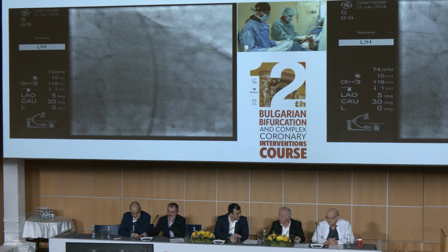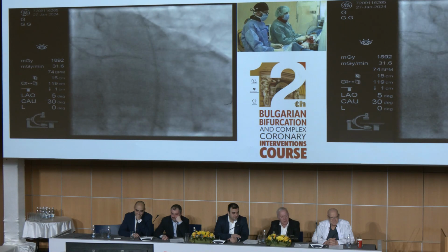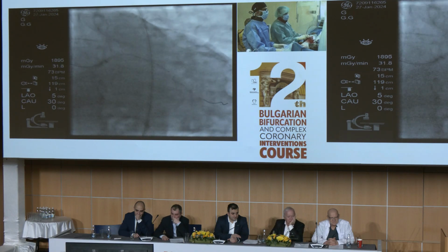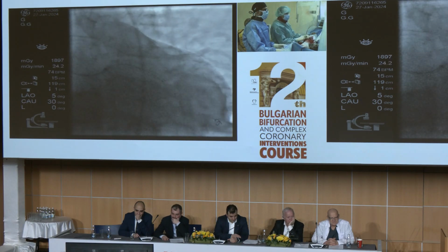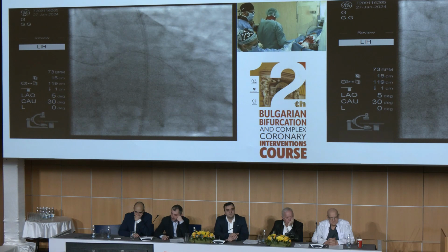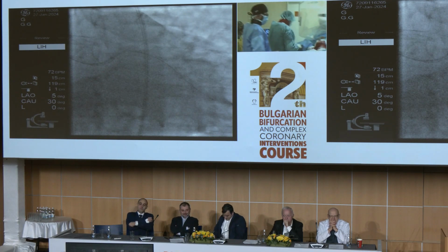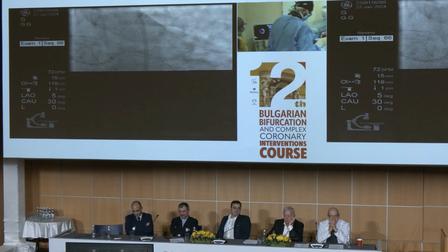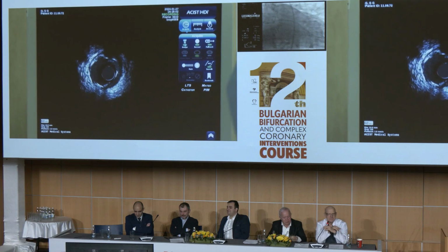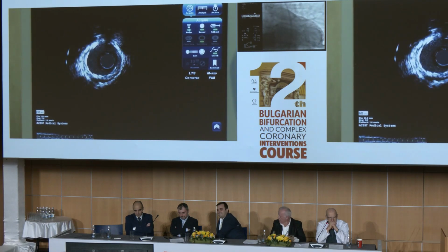Okay. Give me imaging. Okay. So we have now, much better.